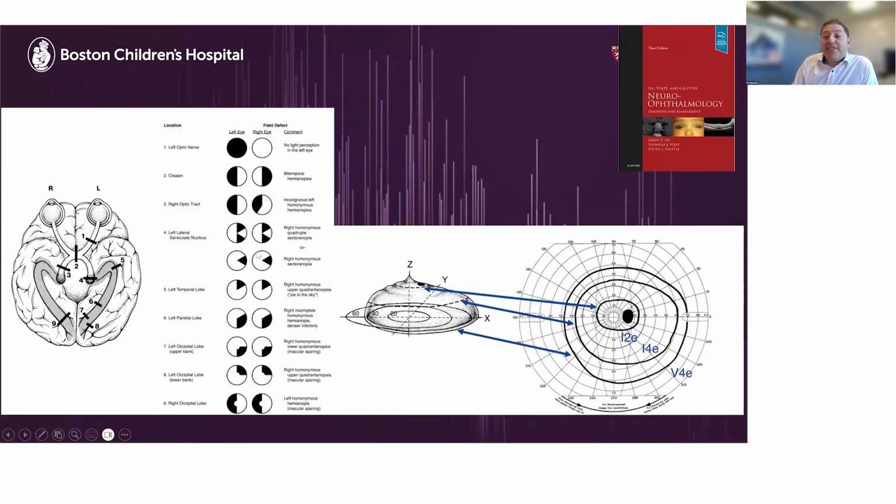that. And then just like with visual fields, depending on where the lesion is, you can have different visual field defects. So if it's in front of the optic chiasm, it's usually a one-eyed problem. And then if it starts at the chiasm and behind, it starts becoming a two-eyed problem, meaning that you see changes in both eyes, not just changes in one eye. And so again, that helps you localize a lesion, and we'll see how that also holds true on the OCT imaging itself.